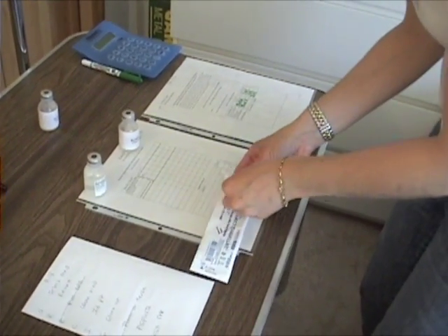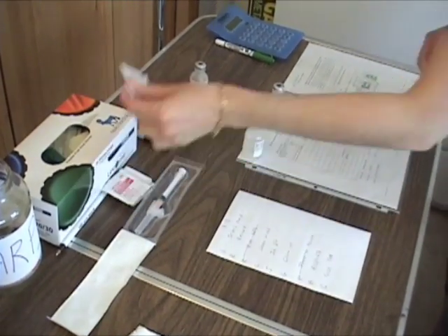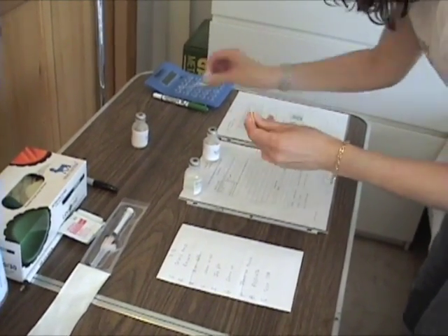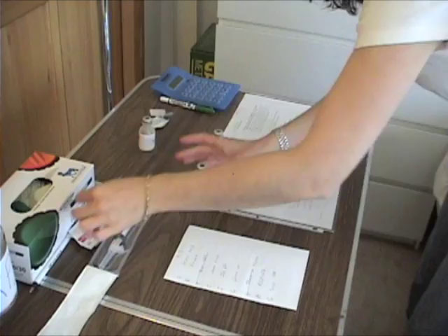So open it, and then make sure to clean your vials. I use 1 cotton for each vial.